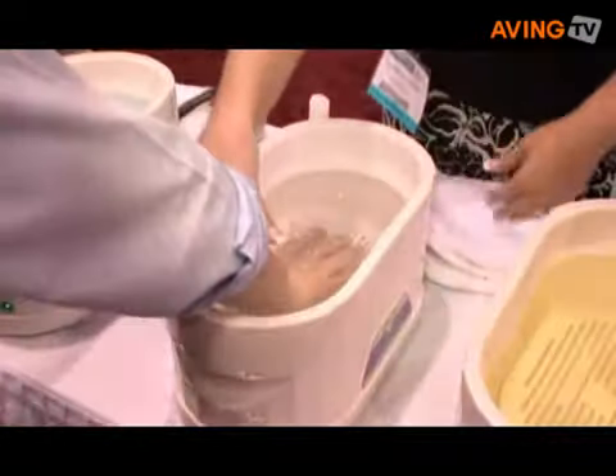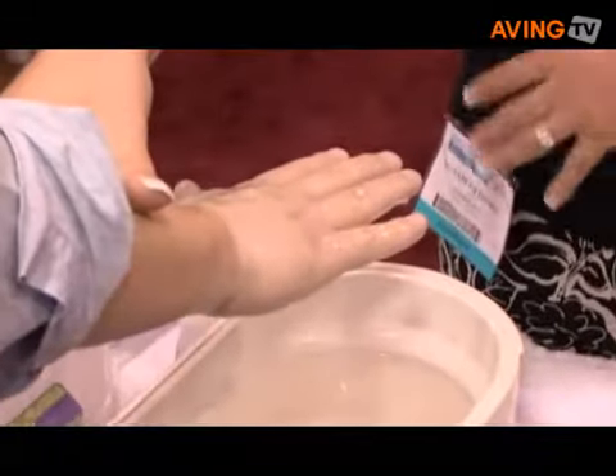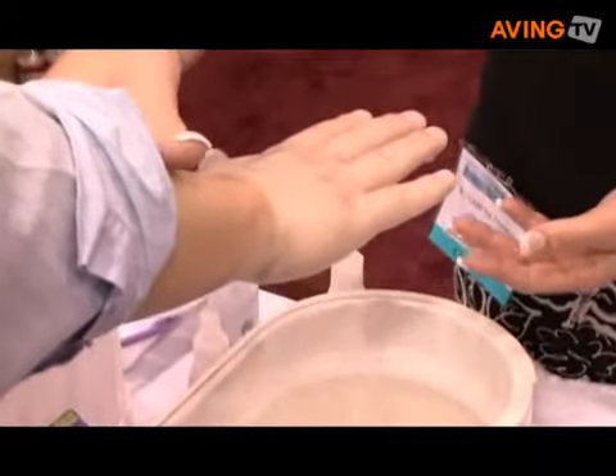As you can see, the wax actually wraps around each joint and each finger, which is great heat therapy for people with arthritis pain because it's going to get around the entire joint and increase blood flow. We wait for that shine to go away and then dip again — you're going to dip two more times. The reason we wait for that shine is we're adding layers of paraffin. The more layers you have, the more heat benefit you'll have for longer.